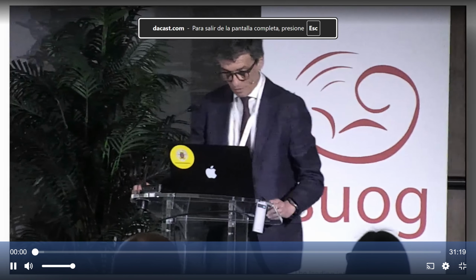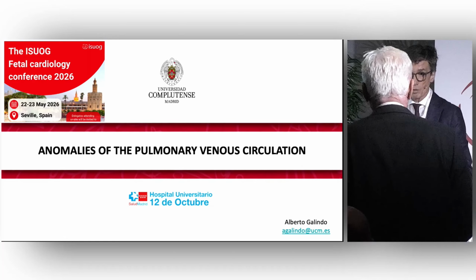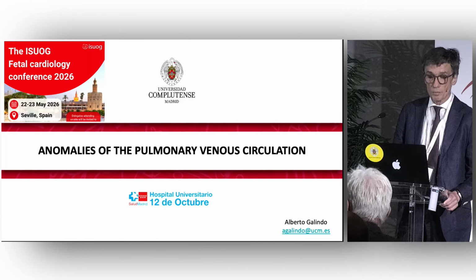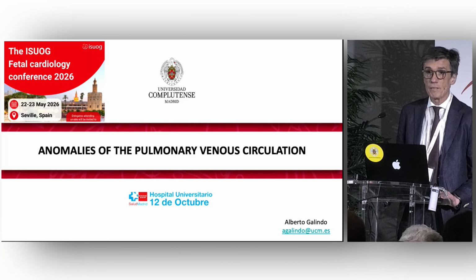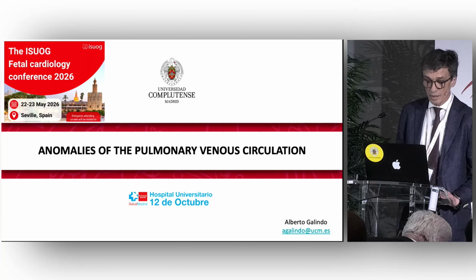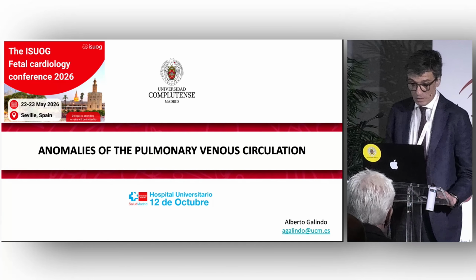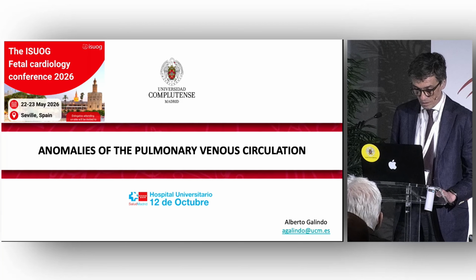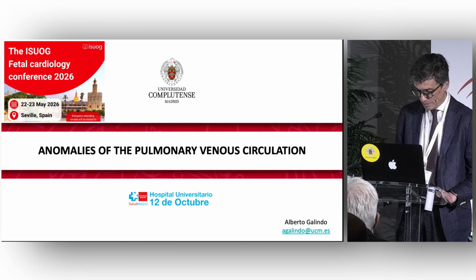This is my third and final presentation today, and also the most difficult one, because it's on a condition that is most often overlooked prenatally, and it's quite difficult to have enough clips to illustrate this lecture. But I did my best, and I will try to show you some examples of these abnormalities that are very important to detect prenatally.